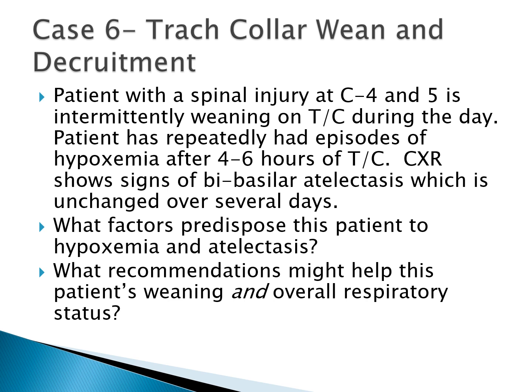So what recommendations might help this patient in overall respiratory status is, perhaps, just very gradual wean, keeping them on the ventilator at night on PEEP. Sometimes these patients like positive pressure. They may actually, depending upon their pulmonary mechanics, they may end up being on some form of non-invasive or semi-invasive. So they may get something like BiPAP through a trach, or eventually, if they are able to get extubated, they end up maybe getting extubated to a BiPAP.